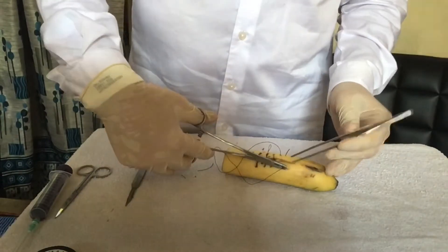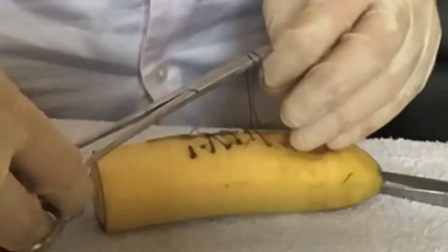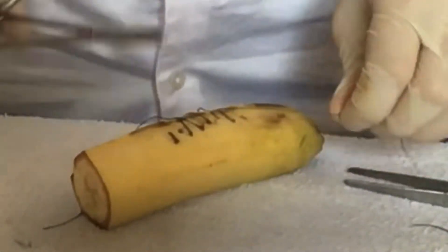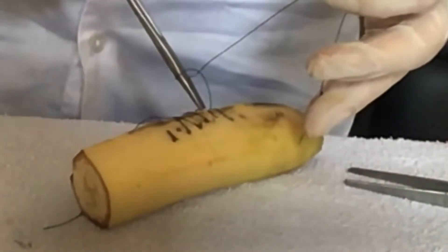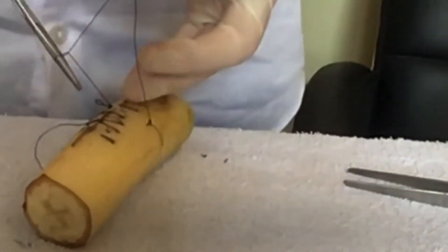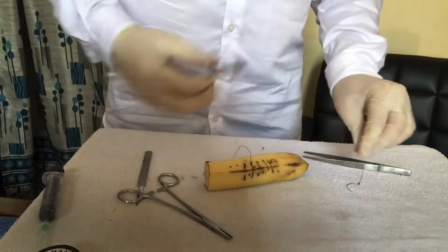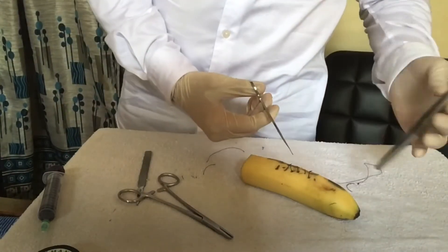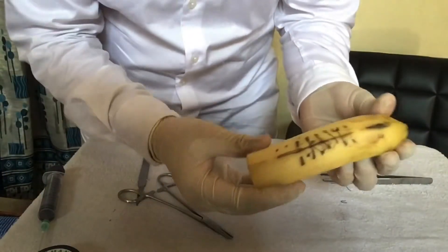After anticipating the last suture, keep the loop open as shown and then tie a knot by pulling that loop towards you, then do it in the reverse direction. You can imagine the loop of the last suture as the short end, and do the knotting in a similar manner as taught previously.